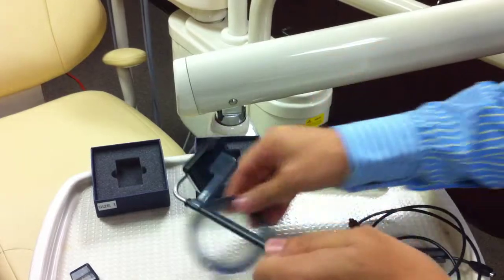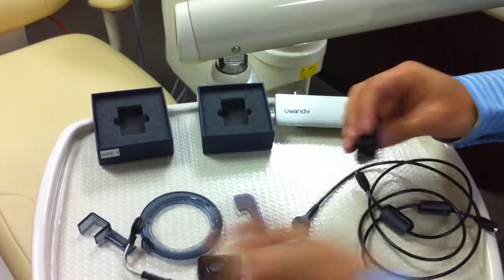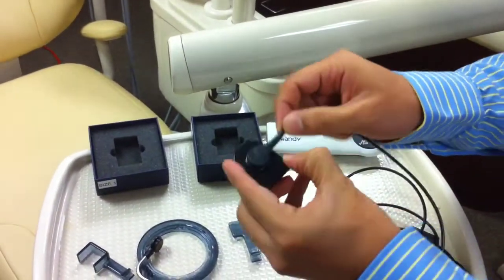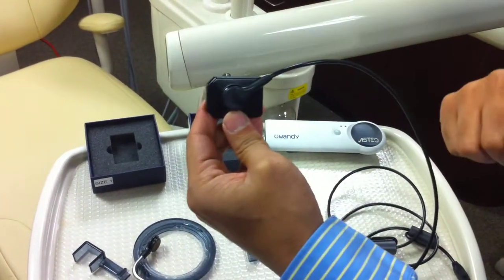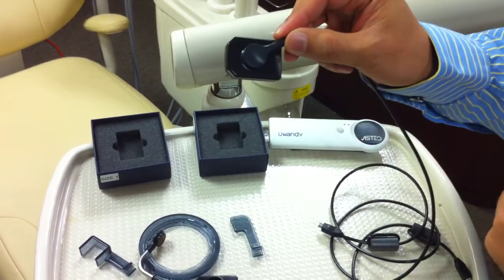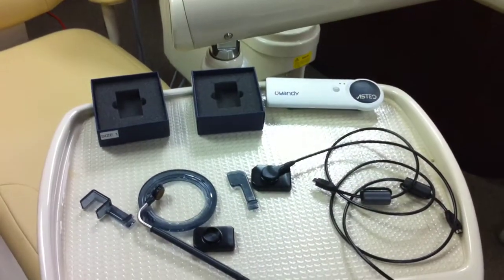If your assistants are used to taking x-rays using a snap array, you could use the flexible cable — snap that on. Once again, it rotates 360 degrees, and I can put the cable at any angle I want so it's comfortable for the patient. I just use a regular snap array and snap it directly onto the sensor to position the patient's mouth. So that is the entire system.